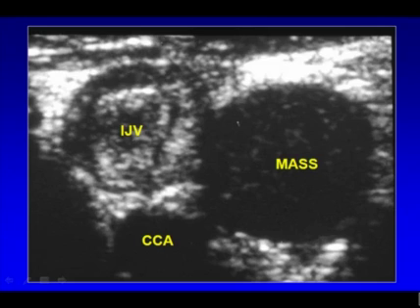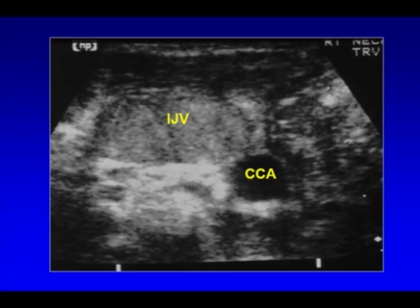This is an ultrasound of the left side of the neck, which shows a mass which does not have any benign characteristics of a lymph node, but the other signal that this is in fact malignant is the fact that it is causing thrombosis of the adjacent internal jugular vein. And this turned out to be metastatic breast carcinoma to the neck. This is a patient with a history of carcinoma of the thyroid and had a palpable mass. When we looked carefully, we realized we could see the common carotid artery on the right, but that the internal jugular vein was completely filled with echogenic soft tissue. So again, a malignant node, not only by its morphology, but by its behavior, invading the adjacent vein.